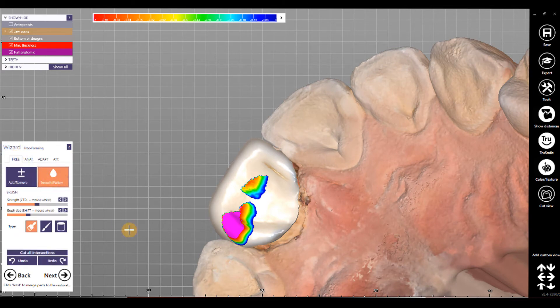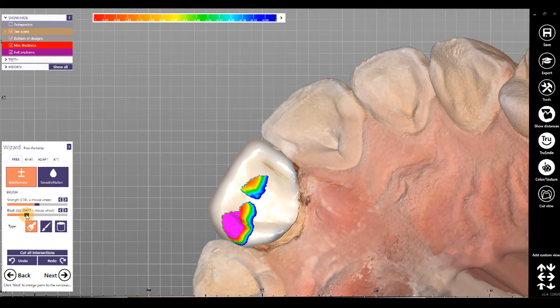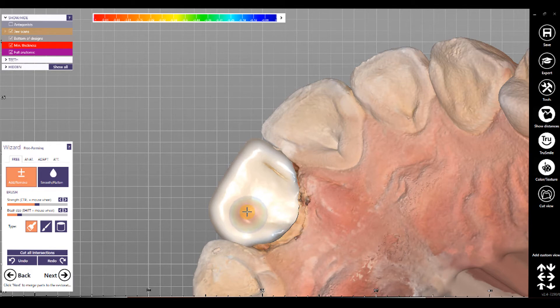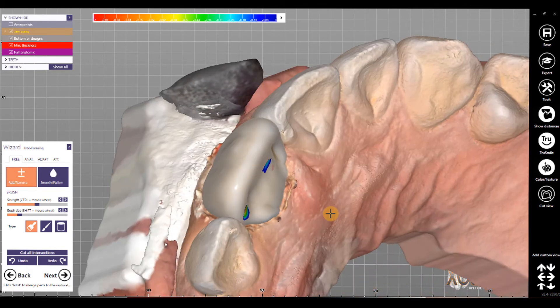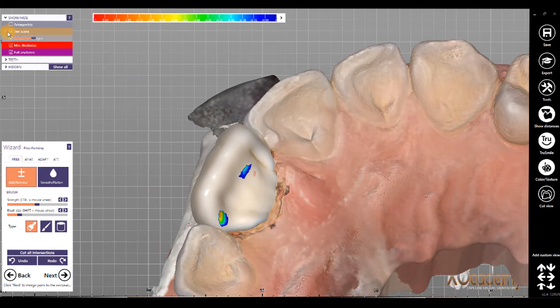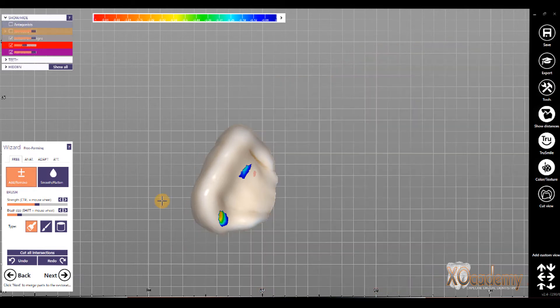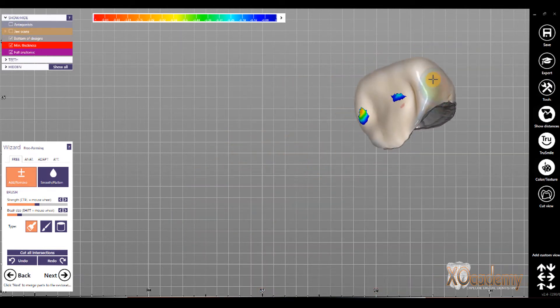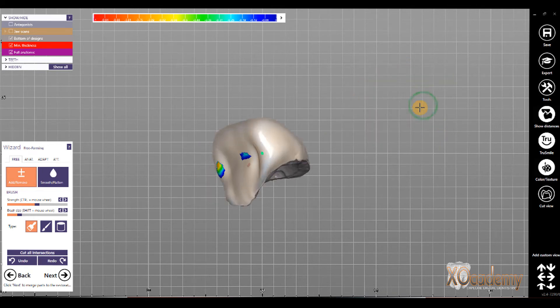So, we go to free form here, and I want to remove all of these heavy, heavy contacts here. So, I remove the contacts. There's a good occlusion for this crown. And now, when I turn off the jaw scan, and I try to adjust the adjacent contacts, I can't see them.